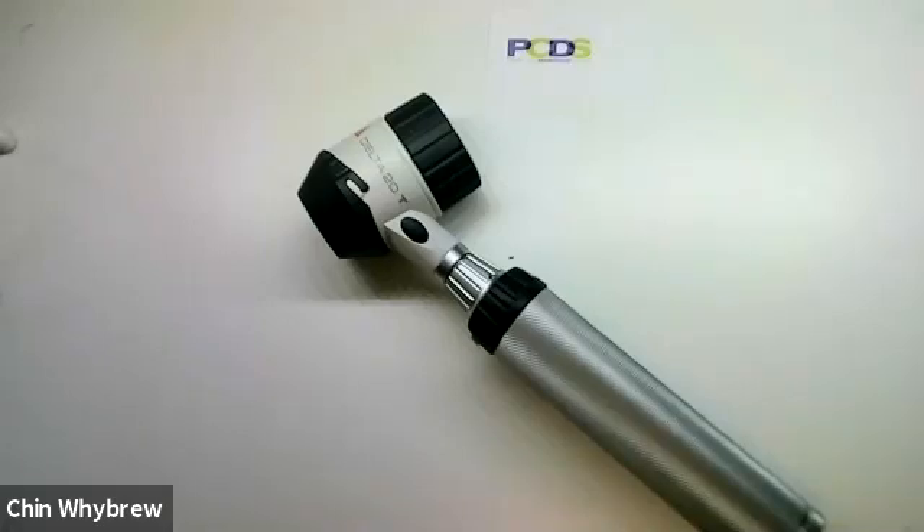Hello, this is the Heine Delta 20T Dermatoscope. Today I'm just going to be showing you the equipment. If you want to learn how to use it in more detail and to interpret what you see, please do come along to one of our Dermoscopy for Absolute Beginners courses.